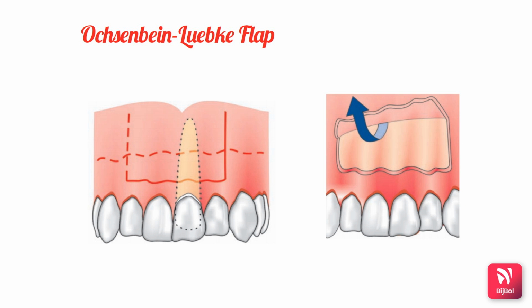The most advantageous thing with this flap is that it does not involve the marginal and interdental gingiva, and there are unaltered soft tissue attachment levels.